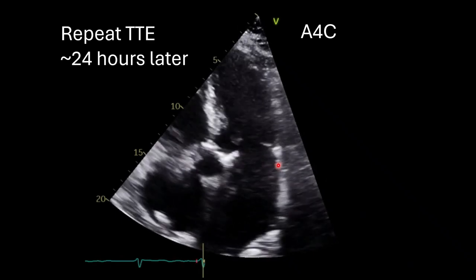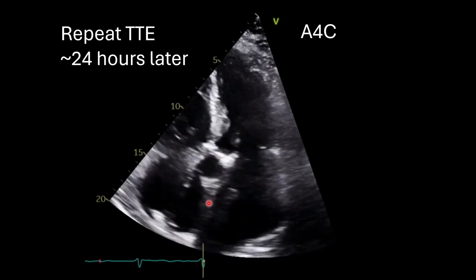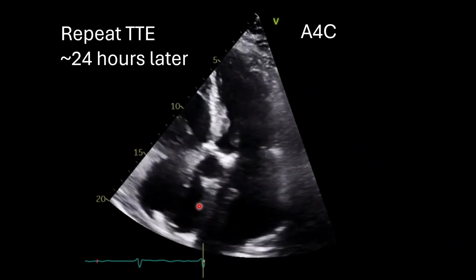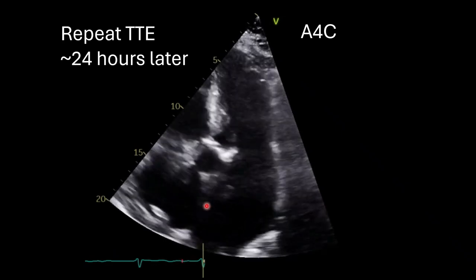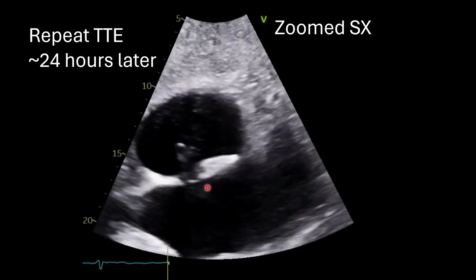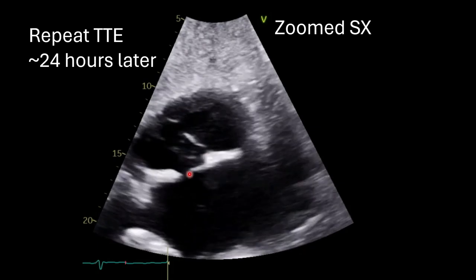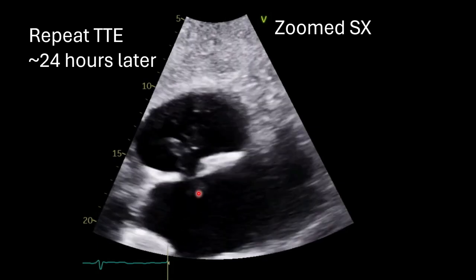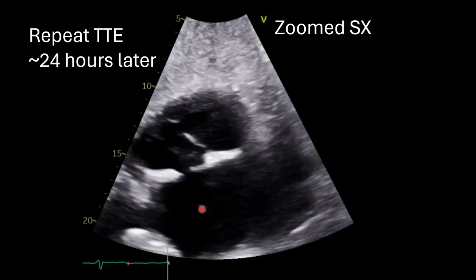If we move to the apical four-chamber view again, you'll notice if you look very closely through the interatrial septum, there is an echogenic mass right here. This is the clot actually becoming stuck in the interatrial septum. In this sub-costal view zoomed in on the interatrial septum, you'll notice the clot wiggling through the interatrial septum.